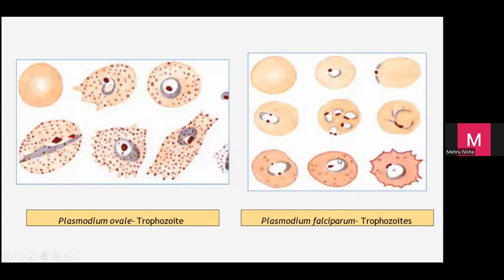Okay, so this is a thin blood smear. Have you all learned thin blood smear? Have you learned thick and thin? Thin blood smear, you put one drop of blood on the slide and you pull it. Yes, okay. Actually you can unmute and mute yourself if you want to tell the answer. Okay, good. Now let's go through our main lessons.